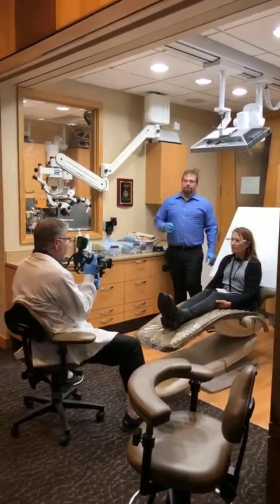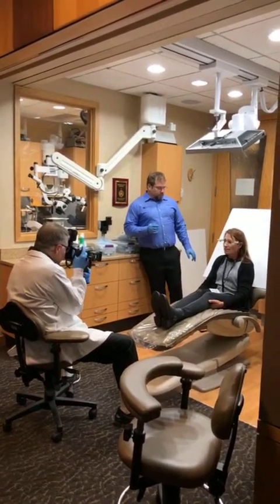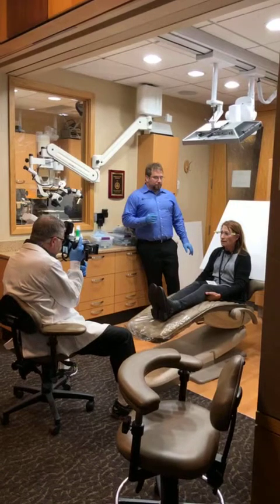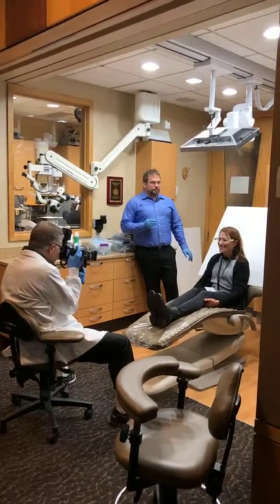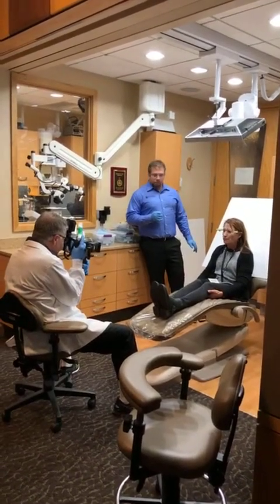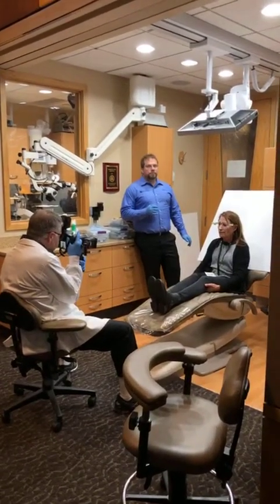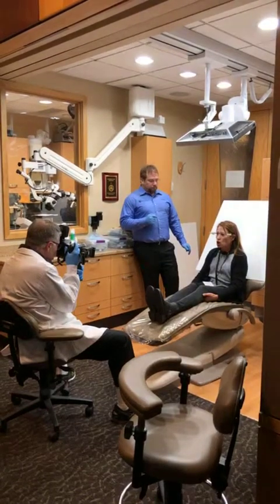Take out the cheek retractors and that piece. Re-level the bubbles, don't move. Now say Emma — we'll watch that go on the screen. As soon as that starts beeping, I'm going to add a smile. Now I'm going to ask for the Duchenne smile — hold on. And then in one more second, the Shush. Hold it.